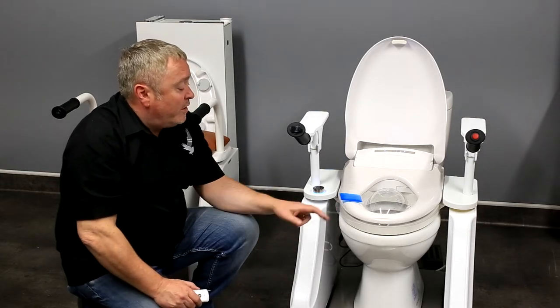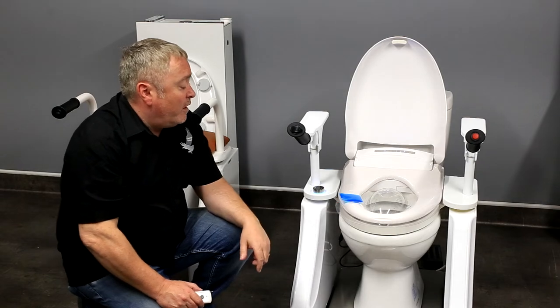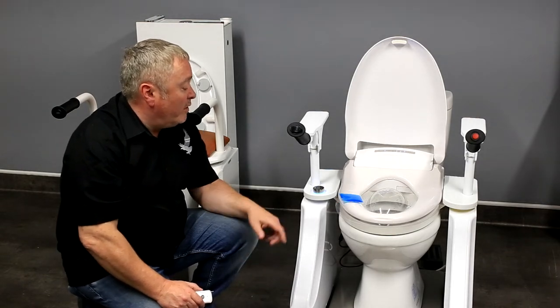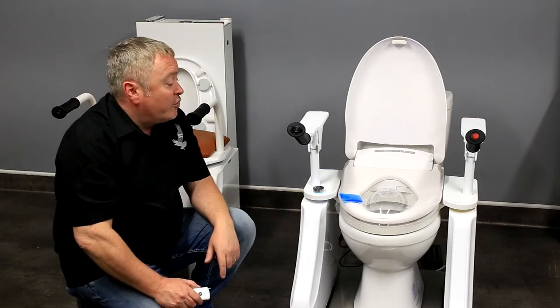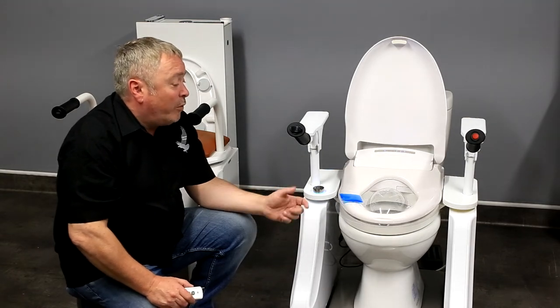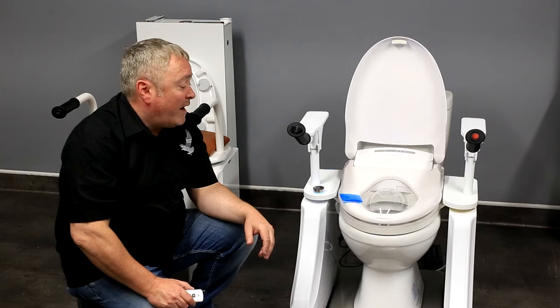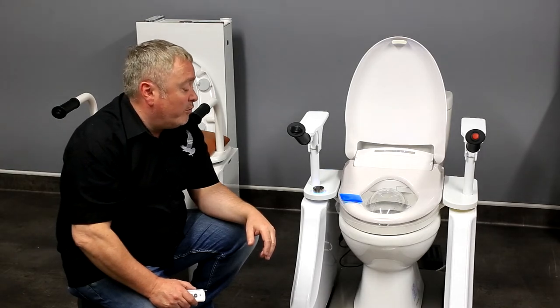The new toilet raiser needs to have a bit of weight on the seat, because it's got a sensor. Once the toilet knows that someone is sat on it, it'll go into command mode. You can then press a range of buttons on the handset, which can operate the wash dry feature of the toilet raiser.